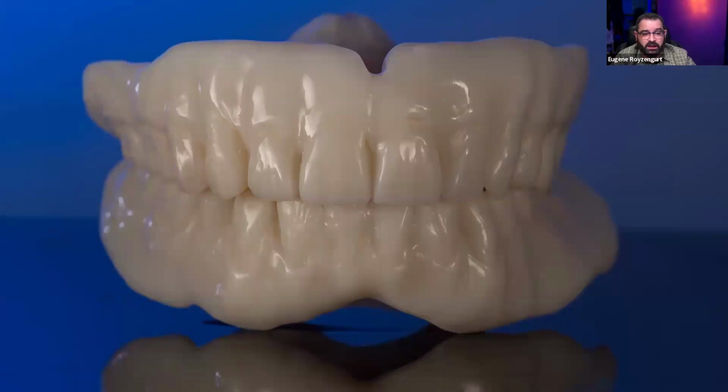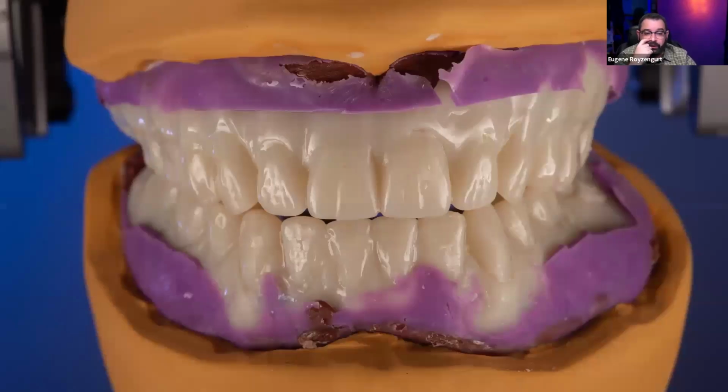Or we would do them in white acrylic, and then basically the clinician would reline these chair side, and we would use that as our final impression and a bite registration at the same time. So basically from this point, we'd go straight to the setup. And a lot of people are still doing it this way. If you don't have digital capabilities, it's a proper way to get things done.